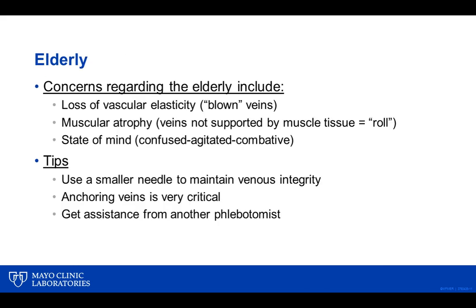When it comes to the elderly, you've got to worry about veins that have already been blown or ruptured. We have to search a little bit harder. It's harder to anchor the veins. We always want to make sure that vein's really tightly anchored. And the other thing you have to worry about is confusion, agitation, combative behavior. You can have all that with an elderly patient.